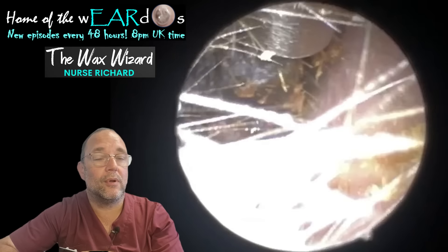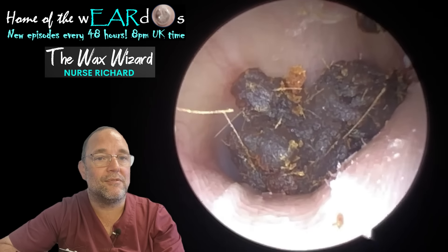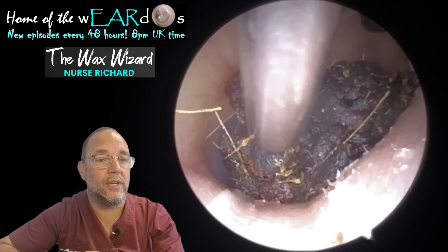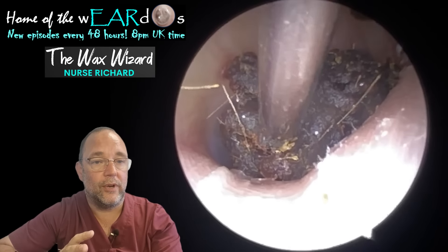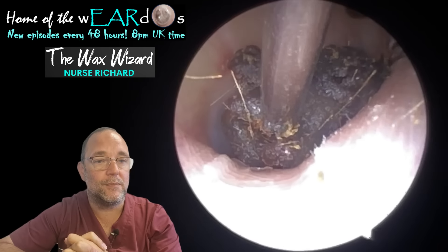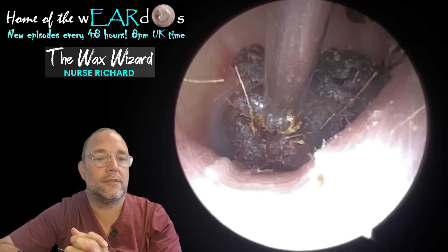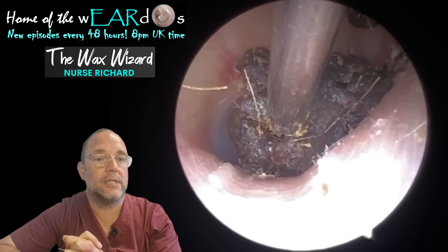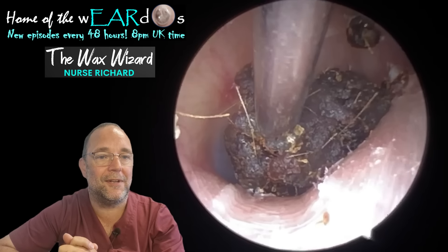Like I said, it's going to bug a few people, but I don't care. This is a medical procedure. This is not made for entertainment — I know you find them entertaining, as do I — but the whole purpose of it is to relieve the symptom. This chap couldn't hear very well. After I removed this one here, he could hear perfectly again. And yes, there were a couple of spots left. Are they affecting his hearing? Are they giving him any symptoms? Not one bit. So we both agreed there's absolutely no reason to go down there with a sharp tool in a very sensitive part of the ear canal near the eardrum, just because it might look good on a video — that's not why we're doing this.